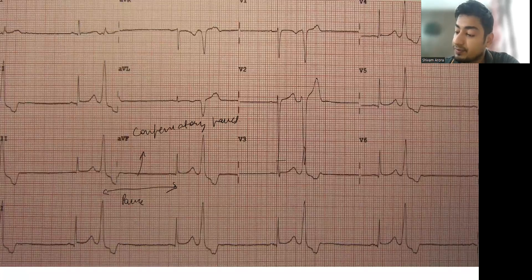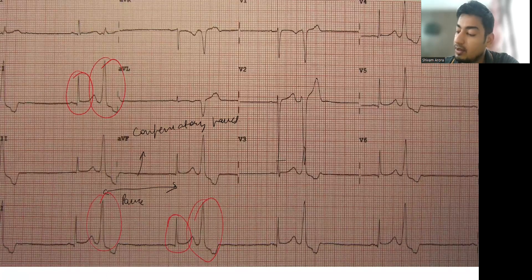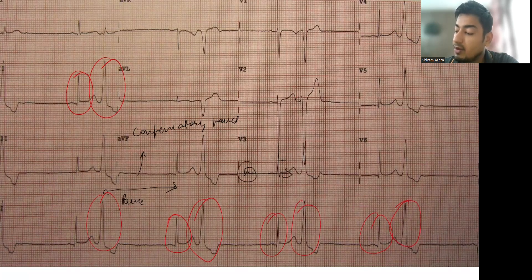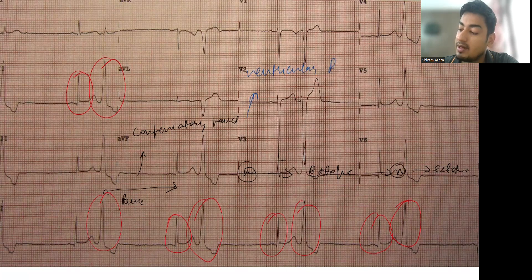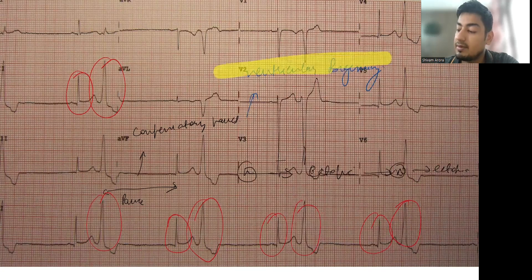The pattern is: normal QRS, ectopic, normal QRS, ectopic — repeating consistently. Every normal QRS is followed by an ectopic, followed by a normal QRS, then another ectopic. Since the ectopic is occurring at every second beat, this is known as ventricular bigeminy.